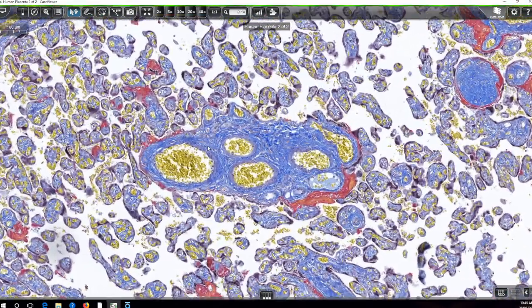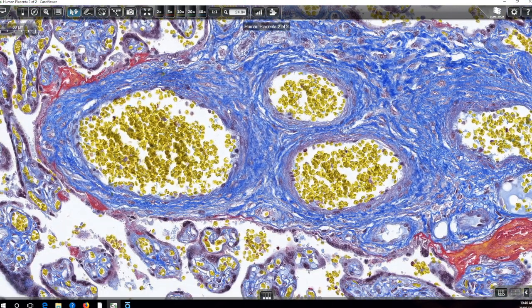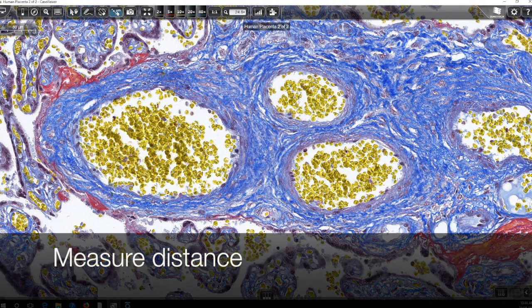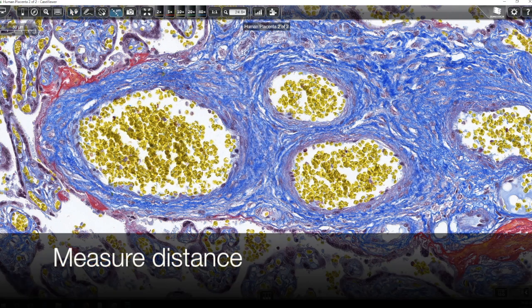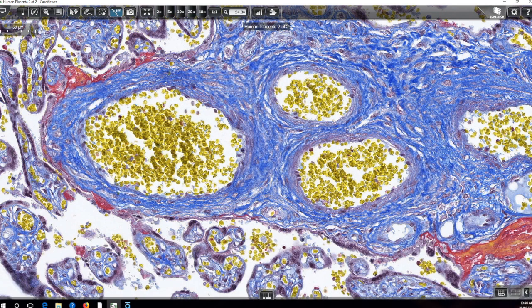The next option that we have using this software is to perform some basic measurement functions. So as you can imagine, a pathologist or researcher may be interested in generating quantifiable data from their histological section. So here we can just drag across using the cursor tool here and we can obtain an approximate measurement for each of these blood vessels.